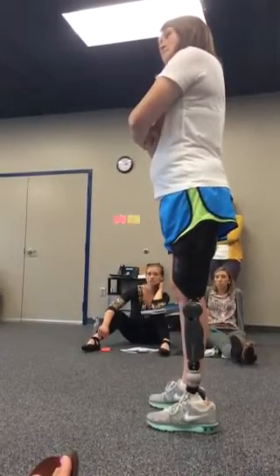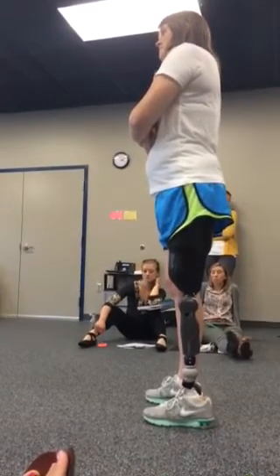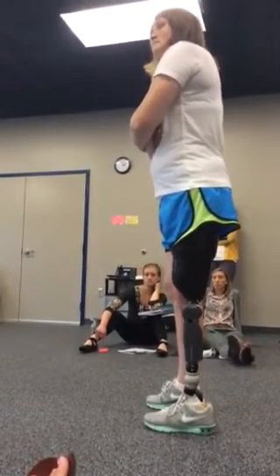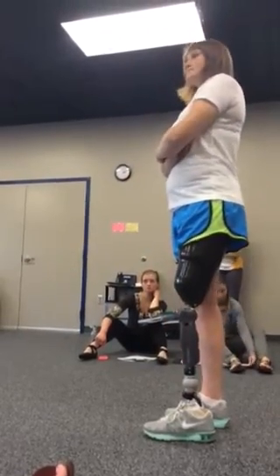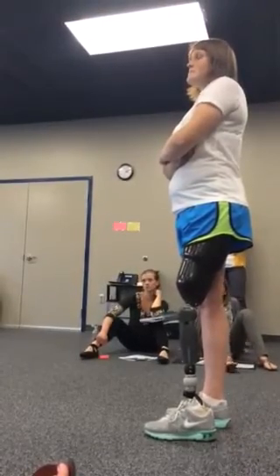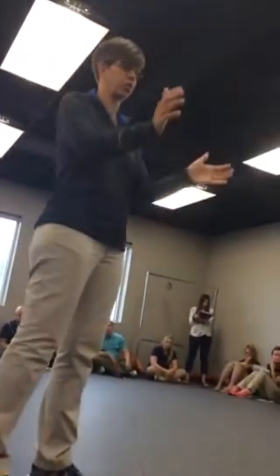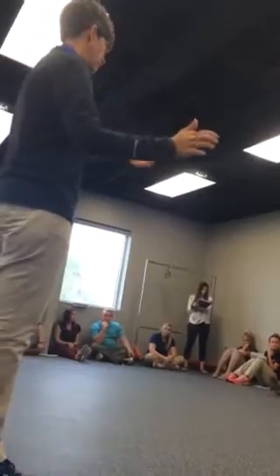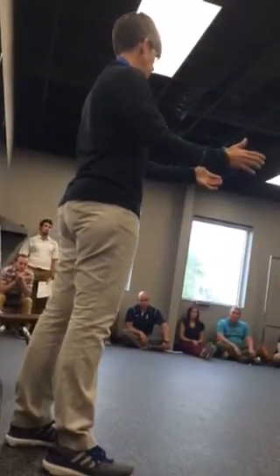So one of the things I want to teach as far as assessment goes is, if you have somebody that's looking a little bit like that, and you're not sure, just like a postural assessment where you're going to put your hands or your thumbs on the ASIS and see if they're level, you can do that when somebody's walking. So you can put your hands on her ASIS, and then just see what's going on. Because what should happen at the ASIS is you should be going anterior, posterior about 5 degrees. So you can just gently, without resistance and not trying to get in her way, put your hands on and then see how that looks.